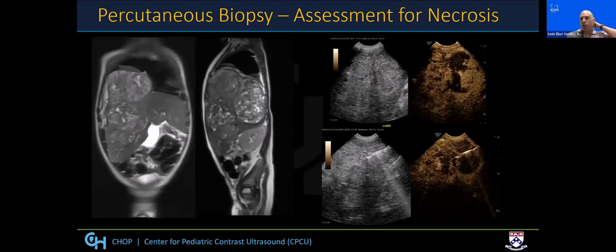This was a 3-year-old male with new hepatic mass and a history of autism. He presented with capsular rupture and was referred to IR for biopsy. On grayscale ultrasound, the extensive areas of necrosis were difficult to appreciate. Following contrast administration, we were able to target lesions that were well perfused and normal background for comparison. The patient was diagnosed with hepatoblastoma, was staged at PRETEXT 2R positive, and proceeded to neoadjuvant therapy, partial liver mass resection. And he is now 1 year off therapy without evidence of recurrence.